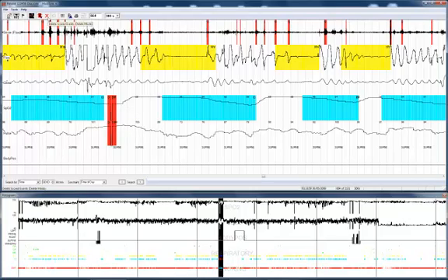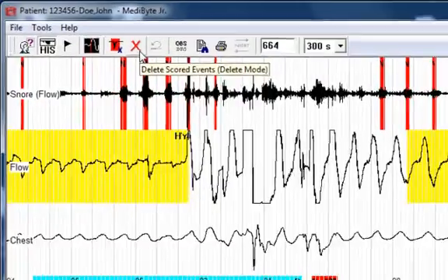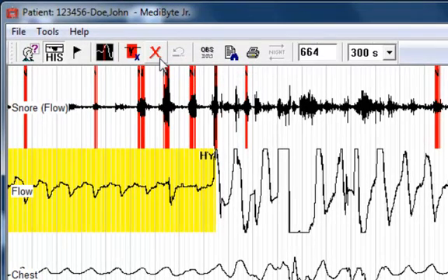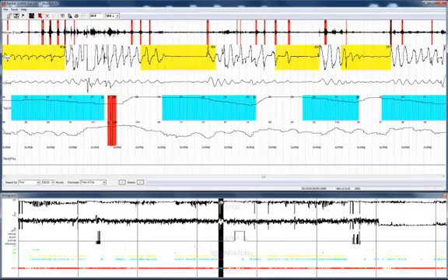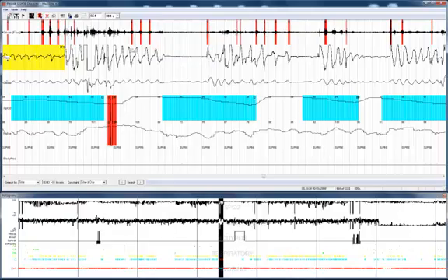The delete scored events button would be used if you're dissatisfied with the automatic scoring and you wish to quickly erase a number of events. Press this button to enter the delete scored events mode. Left click on any event with a single click; you can remove events.